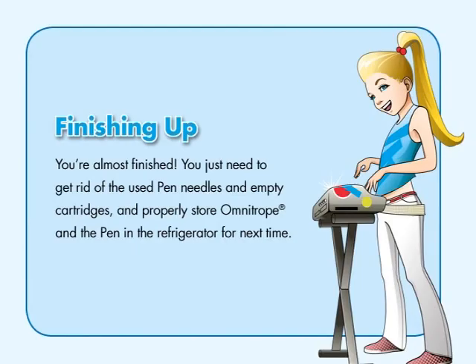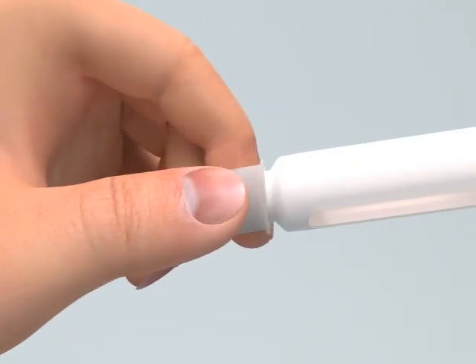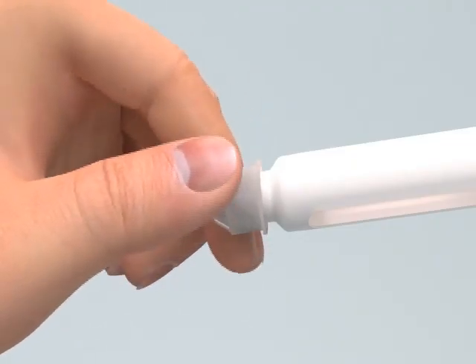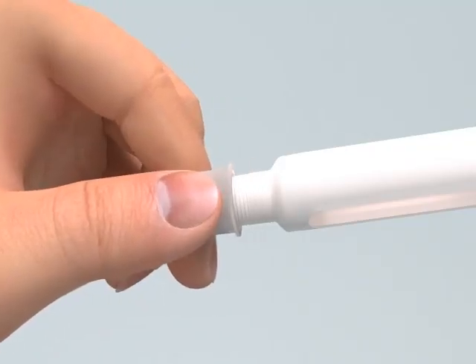Carefully replace the outer pen needle shield. Hold the pen by the cartridge holder and unscrew the pen needle from the cartridge holder.